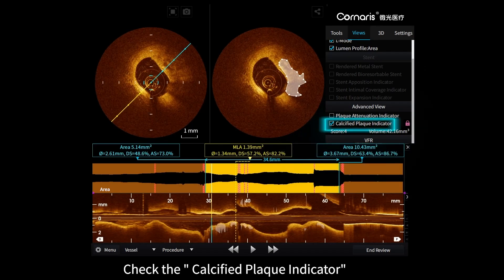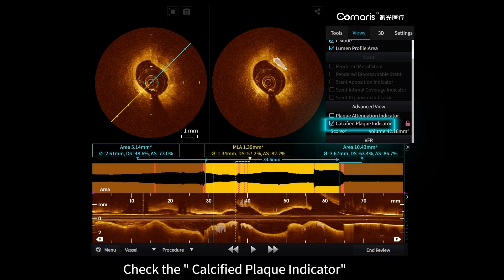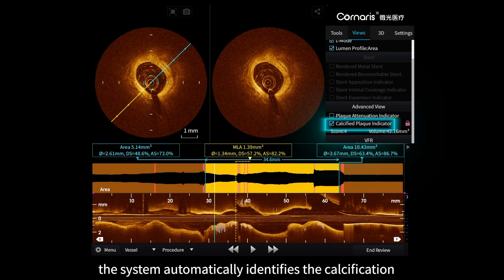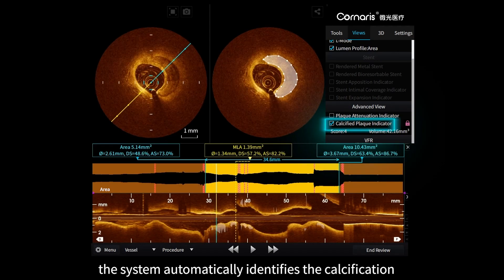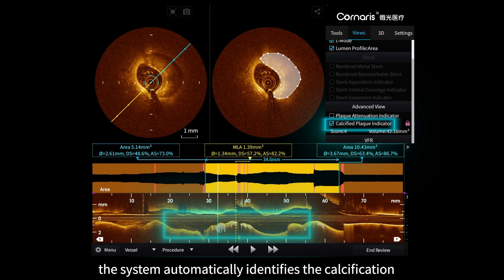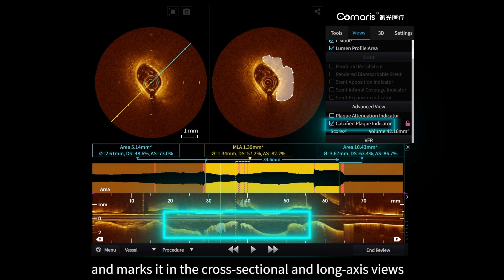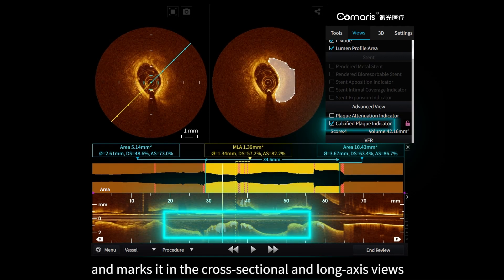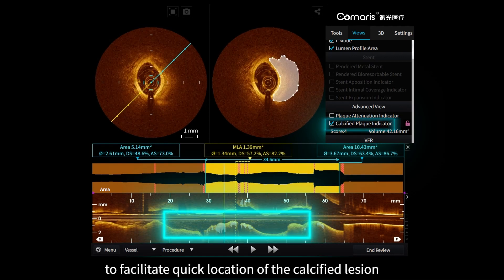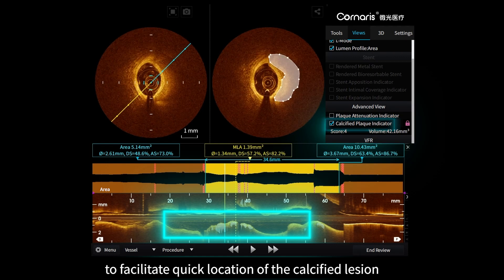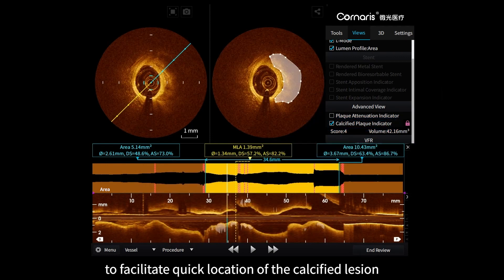Check the calcified plaque indicator. The system automatically identifies the calcification and marks it in both the cross-sectional and long axis views to facilitate quick location of the calcified lesion.